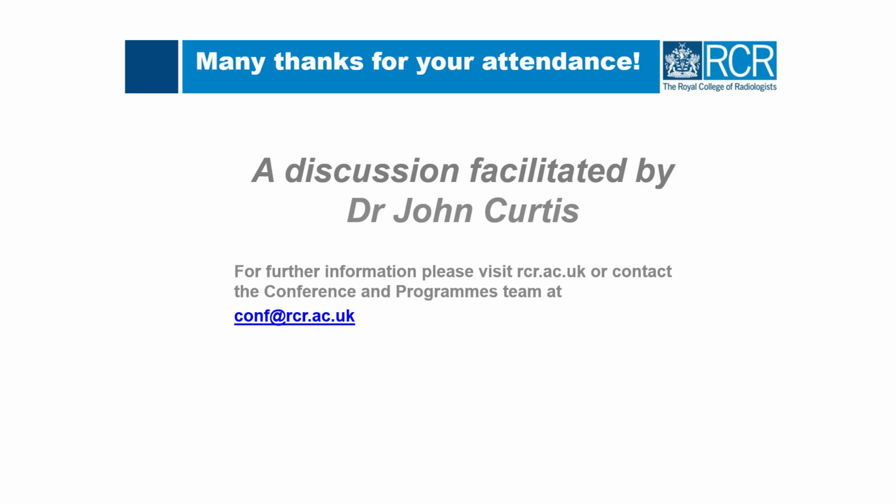But effectively, all of those signs are historical, really, because most patients will get a CT scan. But you've got to remember that in a major civilian disaster, or this present coronavirus crisis, we may not have ready access to CT scanning. And so it's beholden on all of us to be able to pick up all these signs on a chest x-ray.